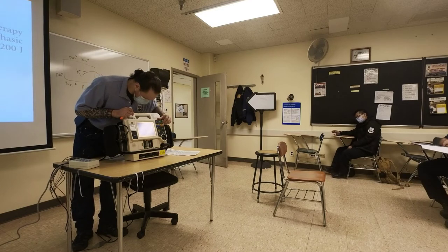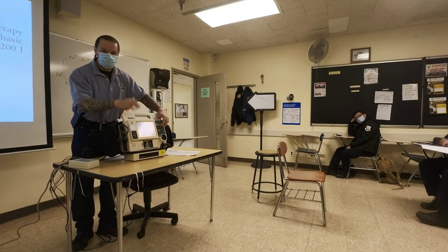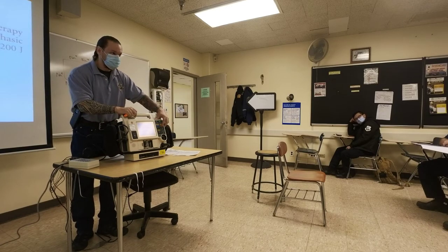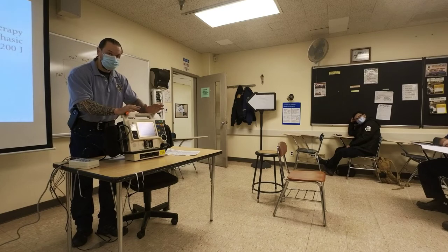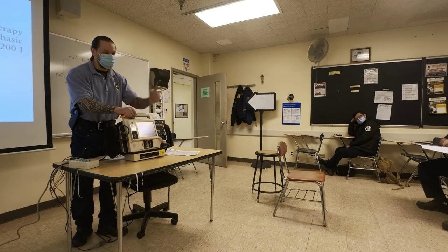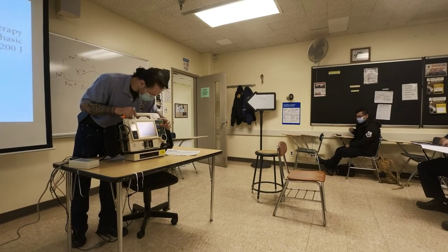You came in and basically did the following. Okay, I'm going to go with 100. I'm going to charge. I want to make sure everybody's clear. Everyone's clear. And what did I just do? Defibrillated. That will be a critical failure, as long as you understand why. Because we want to terminate this rhythm by delivering the shock at a specific time, so synchronization must be engaged.